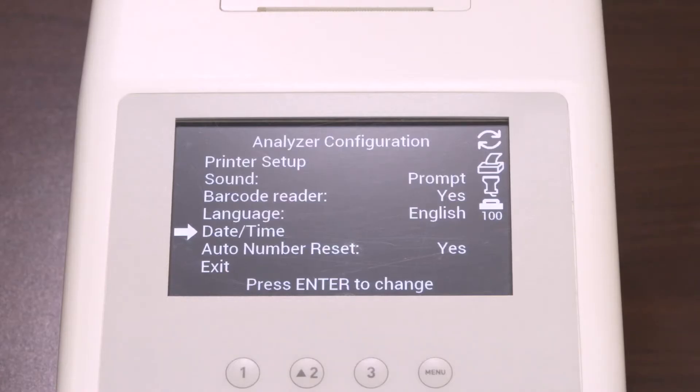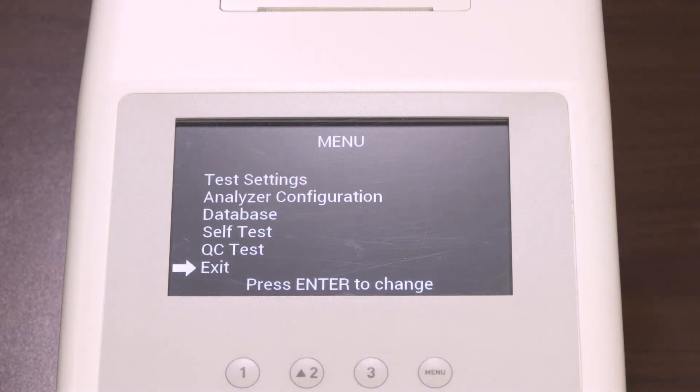The last option in the analyzer configuration is Auto Number Reset. Select Auto Number Reset and press Enter to cycle to Yes or No. If you select Yes, the test number will reset each day. If you select No, the test number is unaffected by the date. Once you have selected your desired option, select Exit to go to the menu screen.